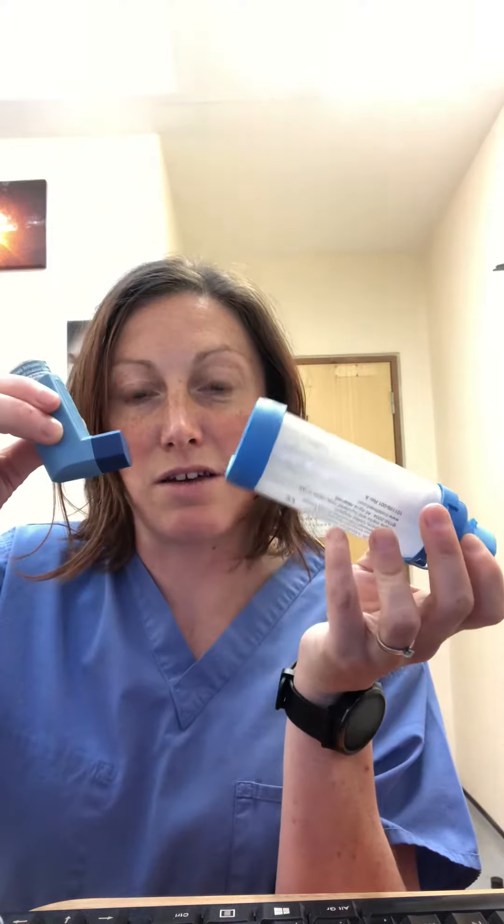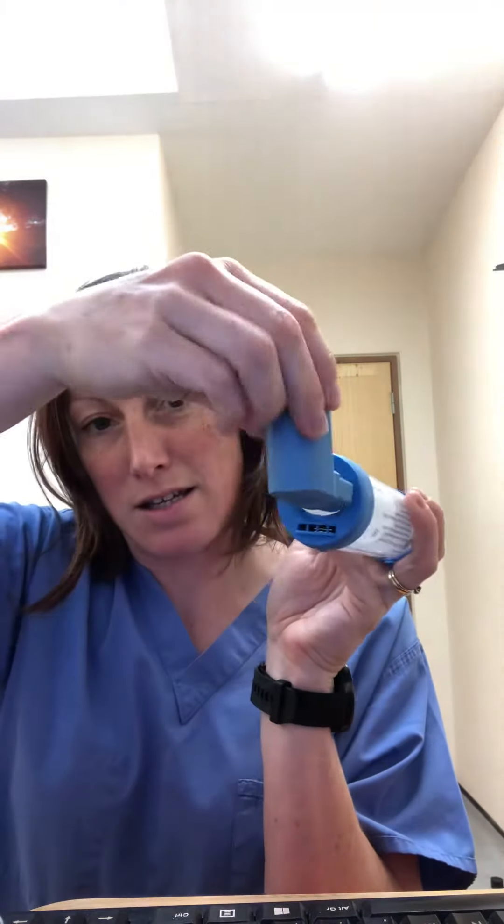This is the AeroChamber spacer and this is how to use it with your inhaler. Shake your inhaler as you normally would and then insert it into the hole at the back here and press down once.